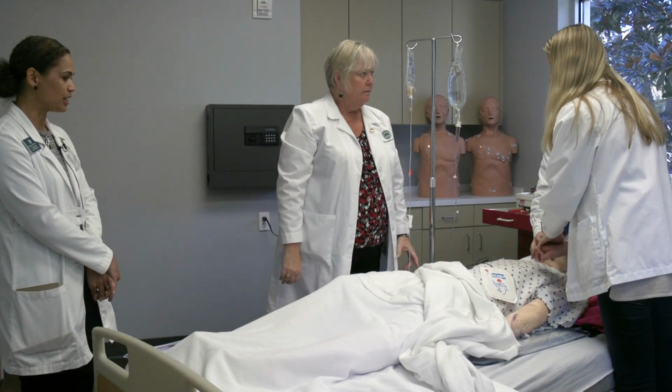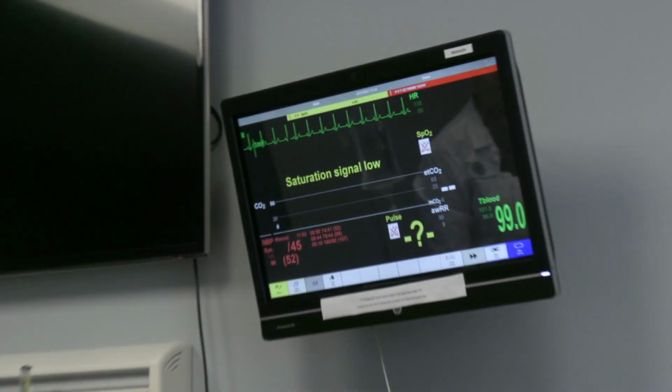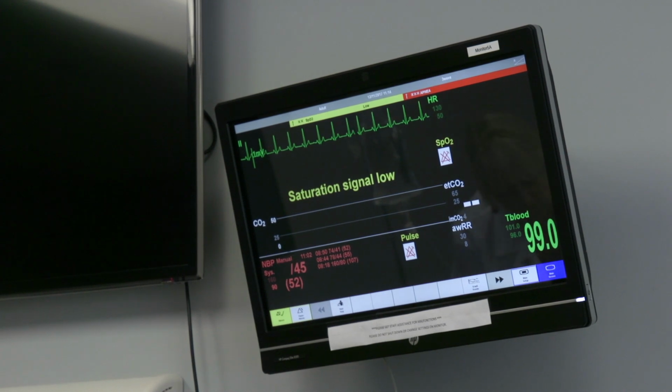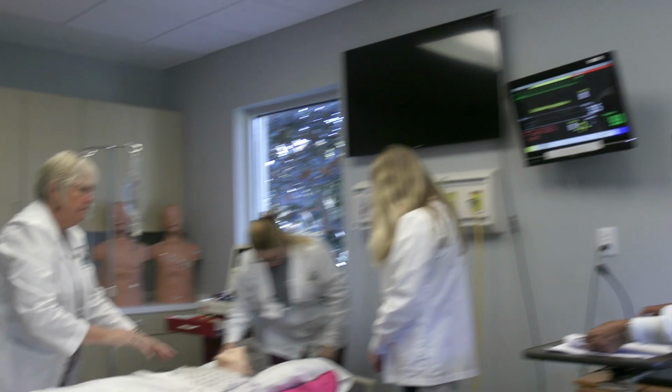We are at a pulse check, so we can stop and check for a pulse. Do we have a pulse? She does have a pulse. Okay, we have return of spontaneous circulation. We no longer need CPR. We can continue the fluids going because she's most likely hypovolemic.